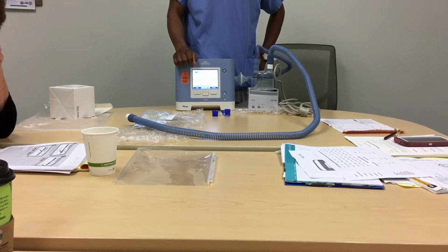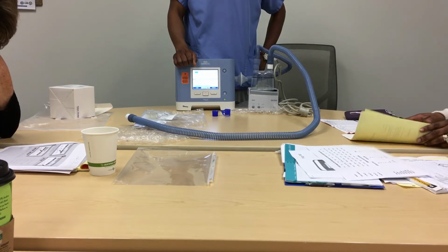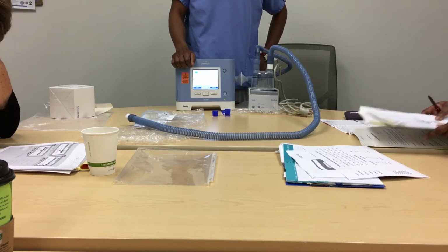Yeah, so usually what we do is, you guys give us the setting you have in the hospital, and then I go with my RTs. We usually go with the height and weight of the patient and calculate the tidal volume target from that, and we'll go from there. That's good to know.